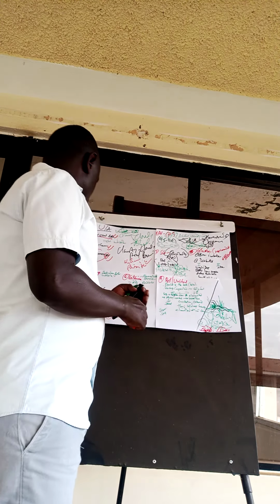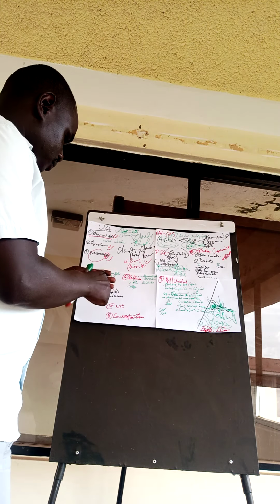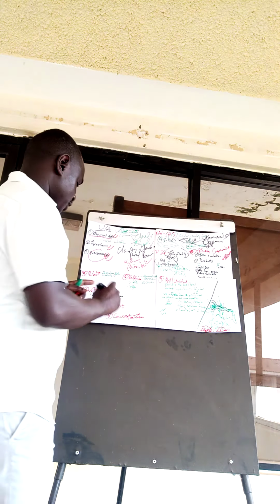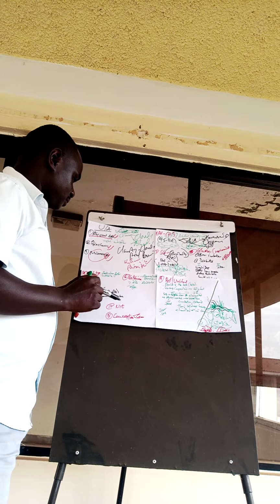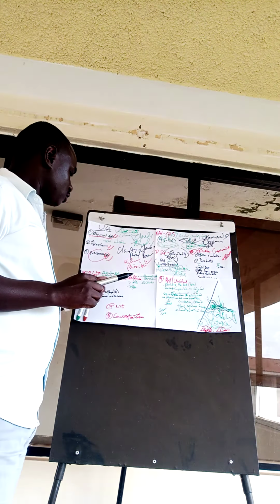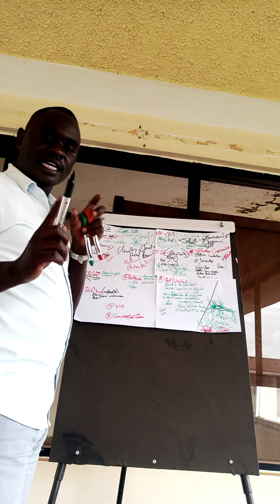The next part we are going to have is the blood. Blood is a very good indicative feature, and it has its significance in the presence of urine. So what happens when there is a presence of blood? We don't just refer to the blood itself; when we are checking blood, we check three aspects.